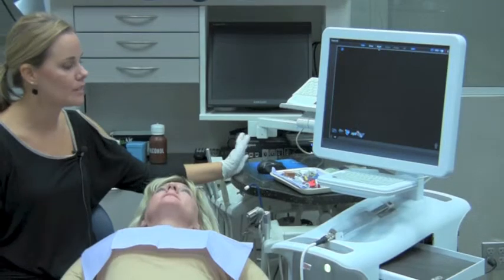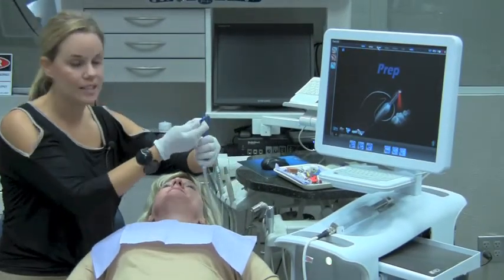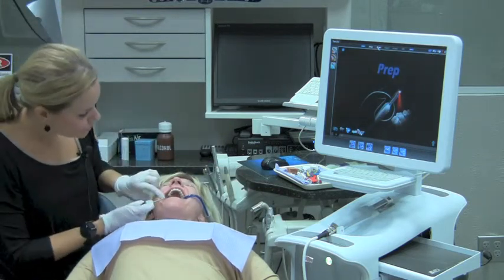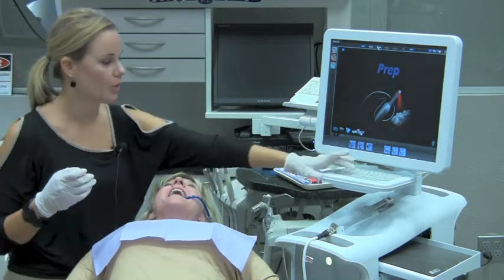I'm ready to now start capturing my digital impression. The tooth does not have to be dry, but what I don't want is any pooling of blood or saliva. So I'm going to dry it off just a little bit to ensure I don't have any bubbles on there. And now we're ready to start capturing our digital impression.